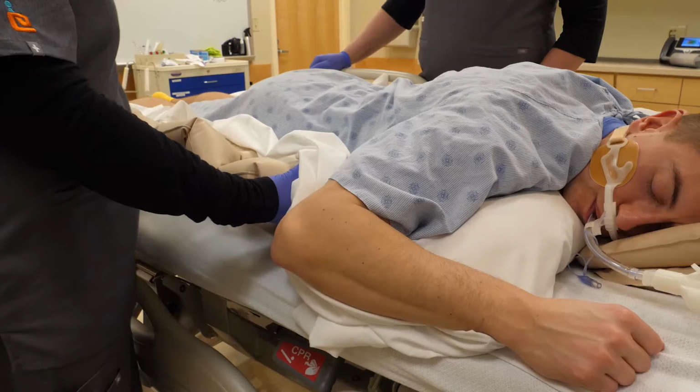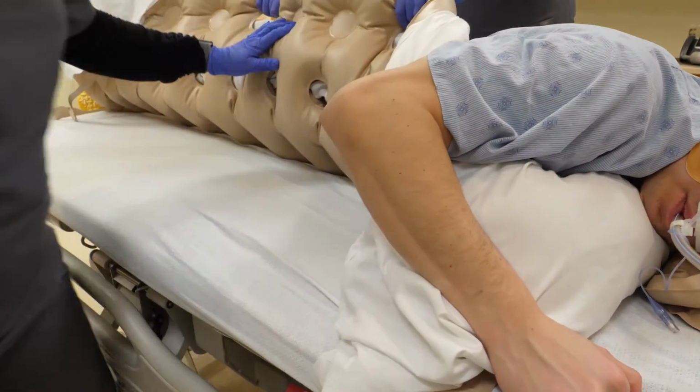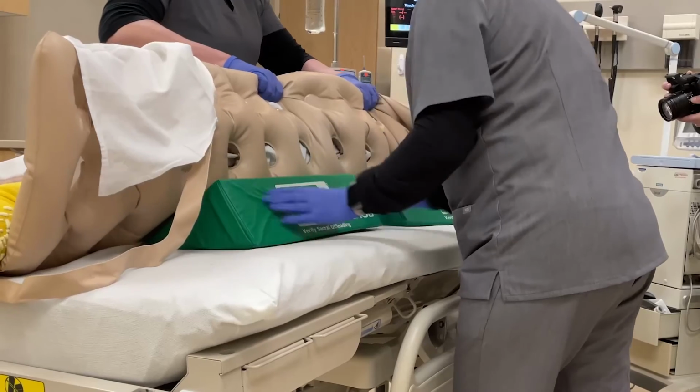The caregiver on one side of the bed grasps the overlay handwells. He or she hands off the overlay to the caregiver on the opposite side while slightly rolling the patient. Place the first position perfect wedge just above the waist area and the second just below the hip area.